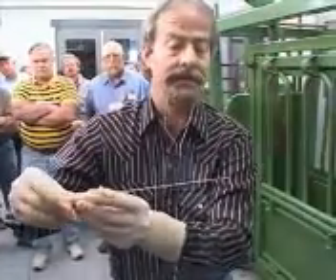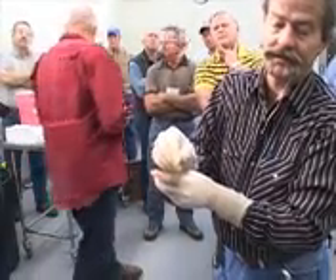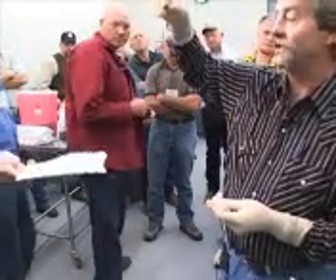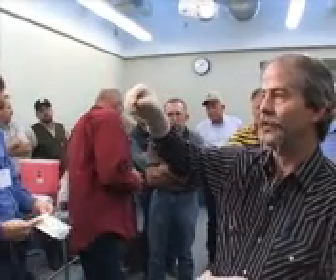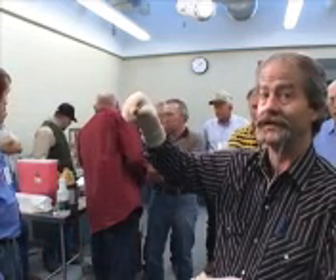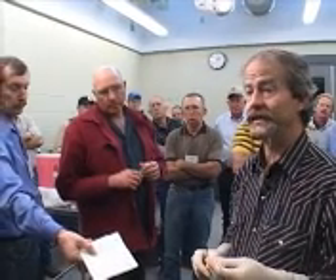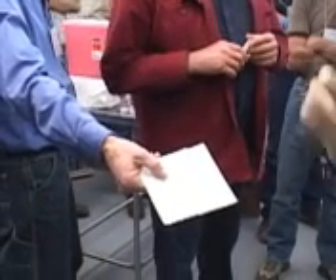When I come out, I've got a piece of liver. It is a very small piece of liver. You can actually reach down and grab this biopsy — that's not very much liver. I can do a mineral profile on two of these true cuts, which gives me about 30 to 40 milligrams of liver tissue. But I can do the full mineral profile on two to three of those very small pieces of liver.